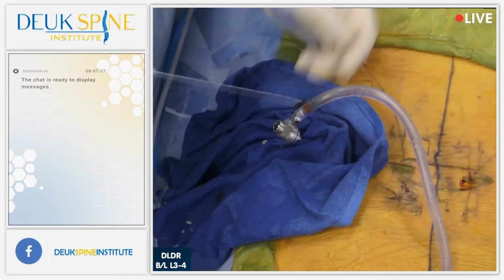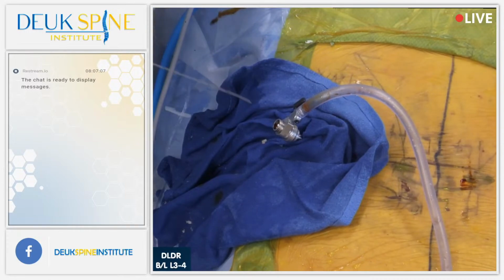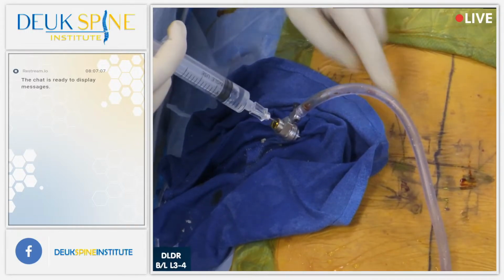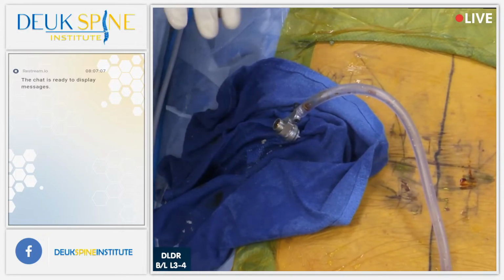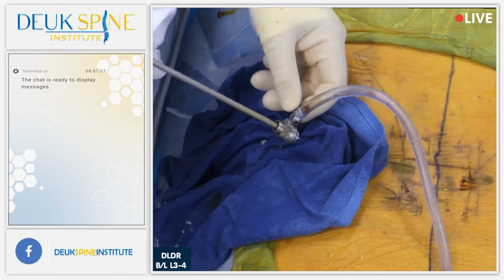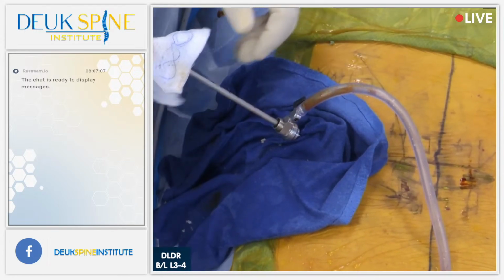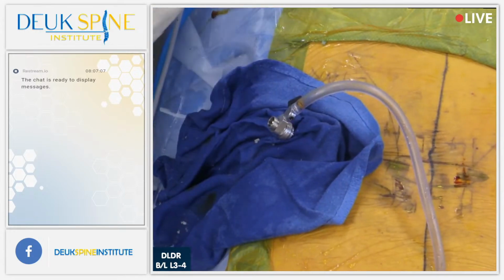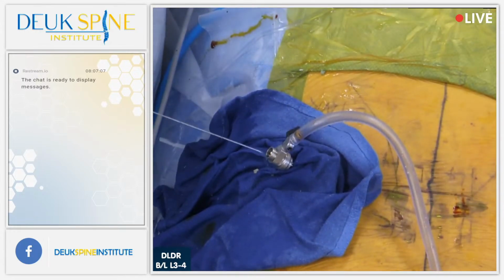I will say this patient not only has the bad disc at 3-4 causing back pain, but also the facets at L4-5, L5S1 on the right side. And they also have what's called a piriformis syndrome, which is a torn muscle in the buttock right here. And Dr. Patel is going to come in and do the piriformis injection to relieve the pain in their buttock.